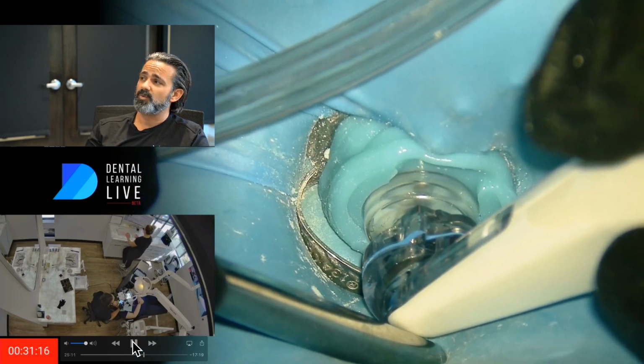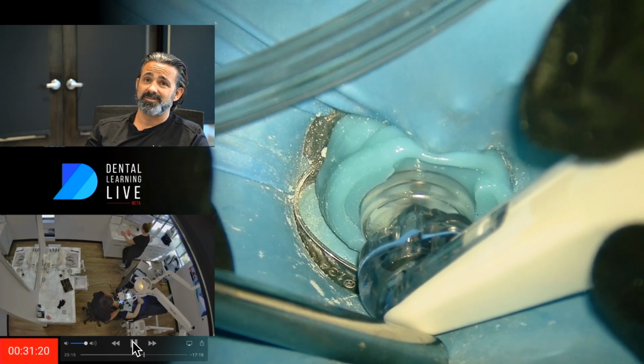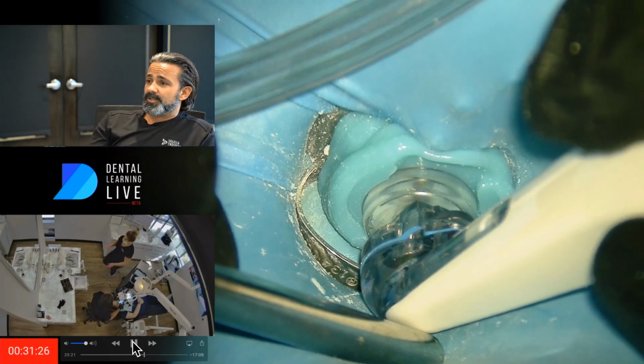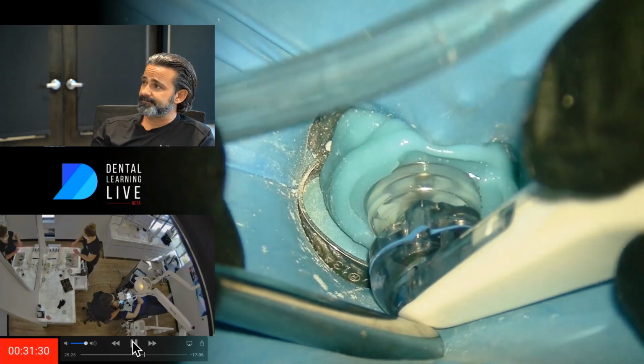We're hoping the GentleWave will discover it, because it's not about making a tunnel to the terminus in this case, or we do surgery. Those are our options. So we're 31 minutes into it, nearing the end.